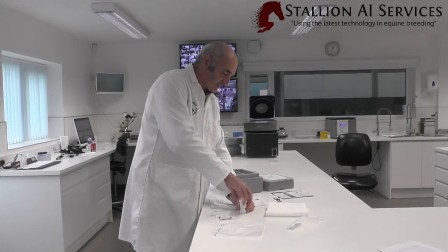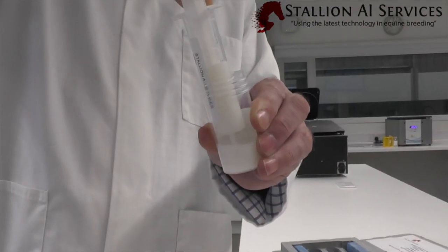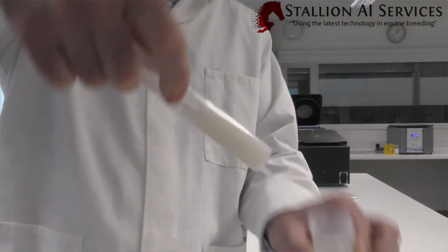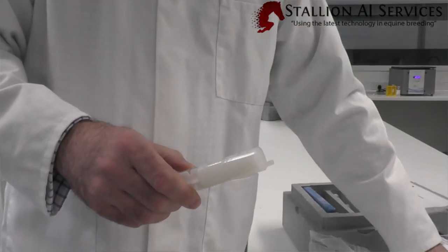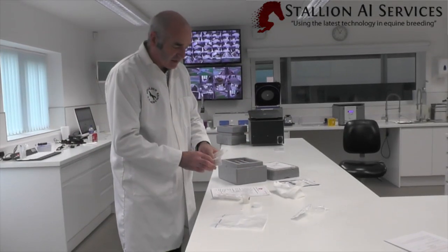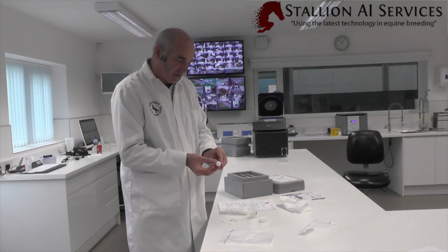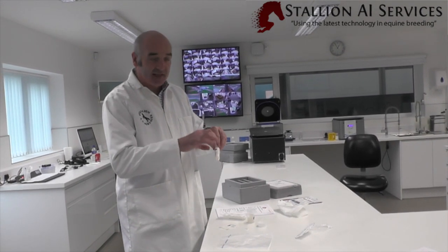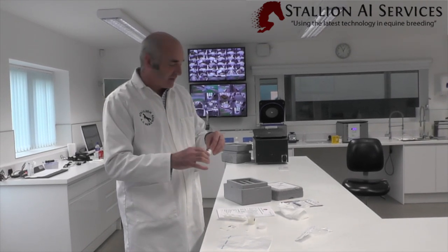We get the semen out. With this particular sample we're sending out 40 mils. We want to clean it and get any residue off. We always want to put a syringe stopper on, and then we want to put a label on here as well, stating the name of the horse and the collection date. It needs to be clearly labeled so the vet at the other end can see who it is and obviously the date of collection.